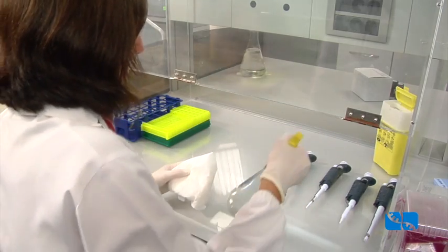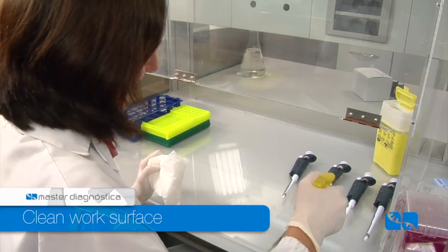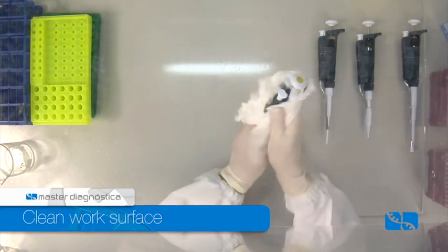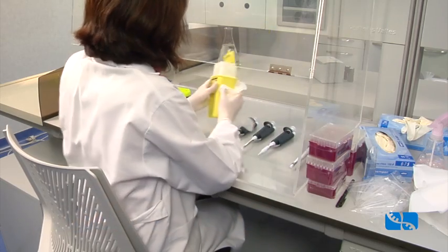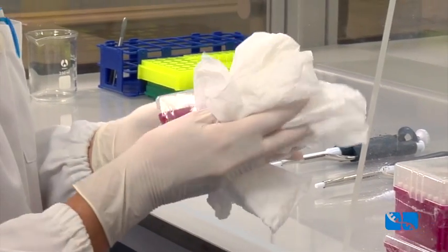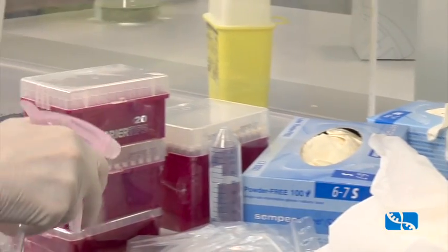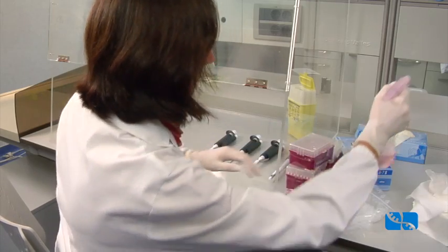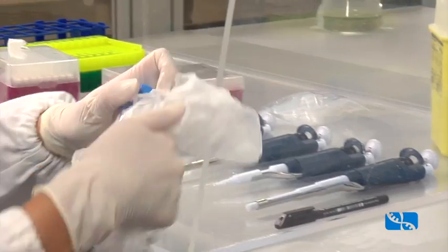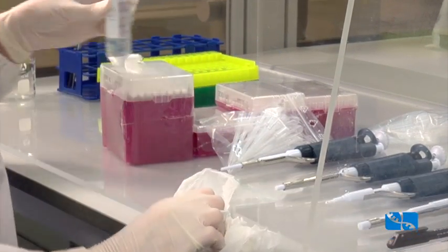The first step before starting with samples manipulation will be to clean work surfaces and the material to be used. Pipettes, waste boxes, tips boxes, and so on. Diluted bleach 1% is recommended for cleaning all work surfaces as well as material. Any commercial reagent which destroys DNA is also an option for cleaning.